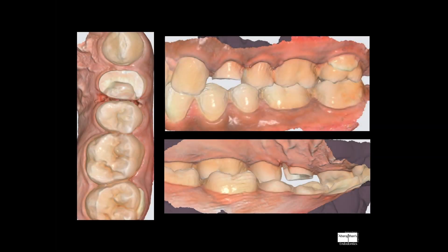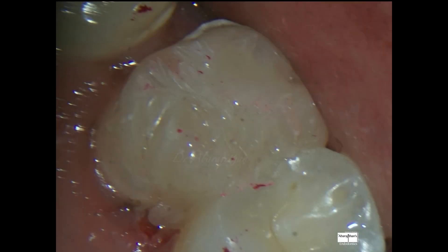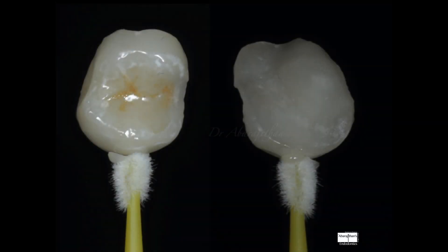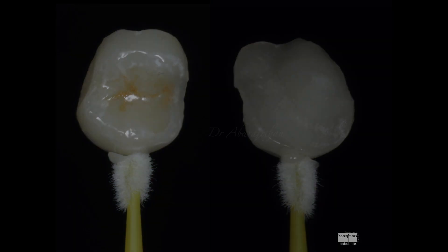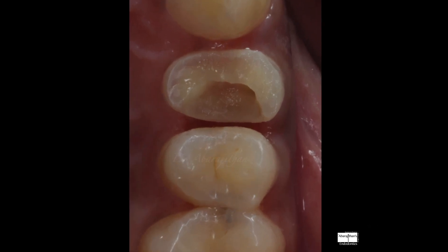Here is my final digital impression; I have also sent my shade to the lab. Now comes a very important point — the importance of temporization. Every time you have done a deep margin elevation, especially involving a gingivectomy, we apply a separating medium over the composite used for the deep margin elevation so that my temporary composite does not bond to it. I then place a temporary restoration, which also holds the gingiva from growing back until my final restoration arrives from the lab.